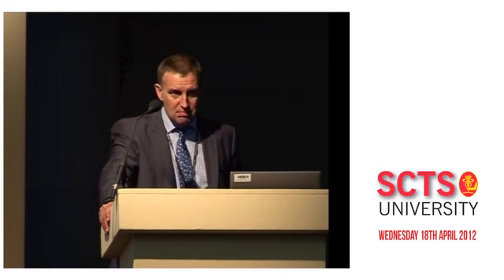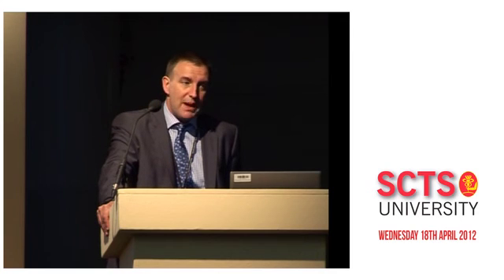shoot down the coronaries. I think we've also seen when you have that sort of small speck, not the fireflies, but a sheet of air, and in one axis it appears very narrow, and as you go around your multiplane, actually you see, in particular in the roof of the left atrium, something that's 2 or 3 centimeters wide, and is clearly much more significant. Yeah, and again, you need to look at the left atrial appendage for air, and again, in the ventricle and hiding in the left ventricular outflow tract beneath a mitral valve replacement.